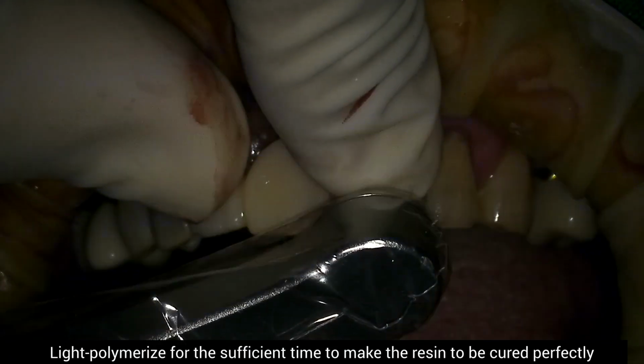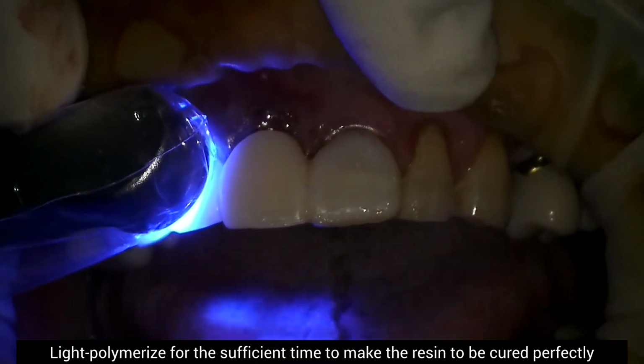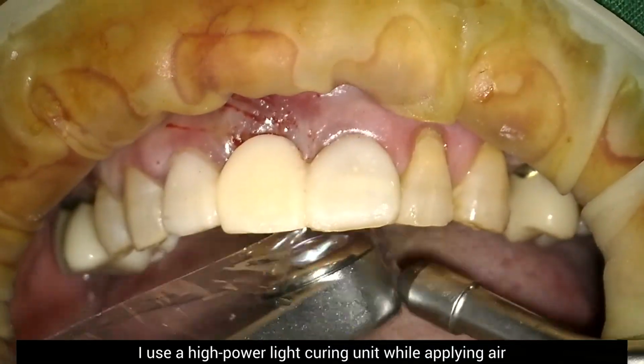Light polymerize for a sufficient time to make the resin cure perfectly. I use a high-power light curing unit while applying air.